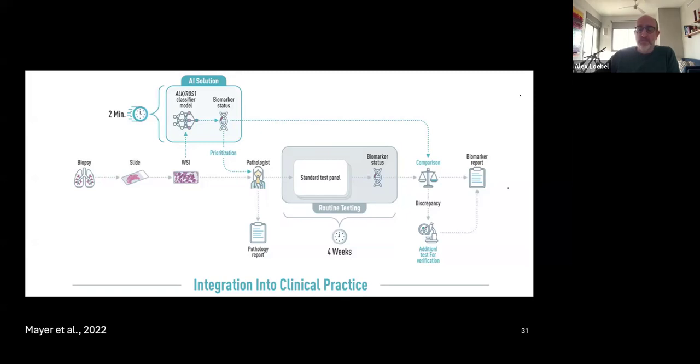So, for example, some of the foundation models were developed in academia. They are open source, and these are the ones that we are using, for example. Some are proprietary foundation models of startup companies, and this is their way of making money. They collaborated with big hospitals that have shares maybe in the startup, or maybe they bought some data, and then they use it to develop a foundation model.